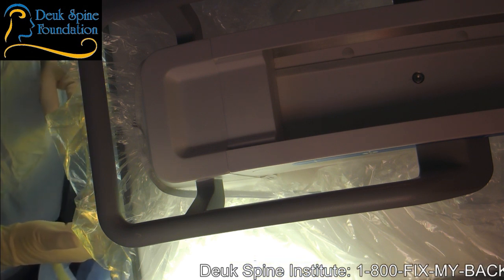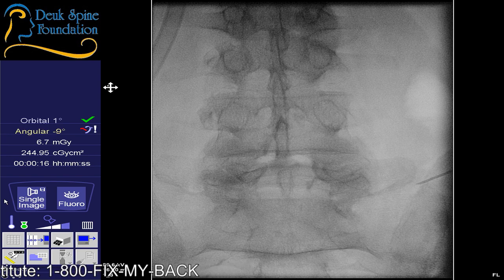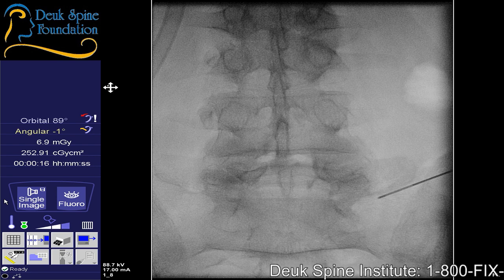Shot. All right. You let me know if you feel any pain, okay? All right. Shot. Lateral view. So what I like to do is I like to come in from a lateral approach. I like to dock on the facet joint and just move the needle anteriorly through the foramen. That's the safest way to do it. Are we good? Lateral view.